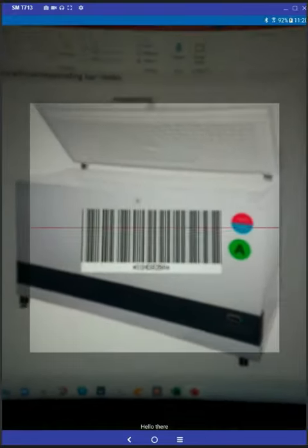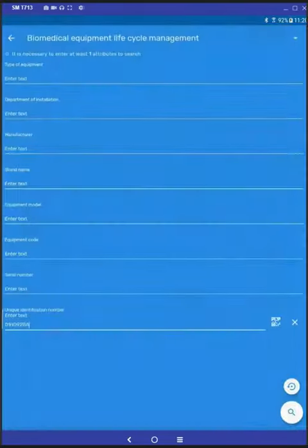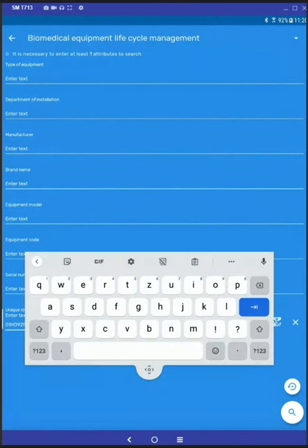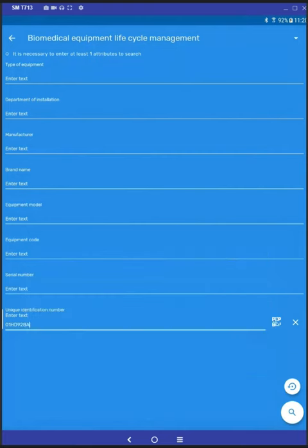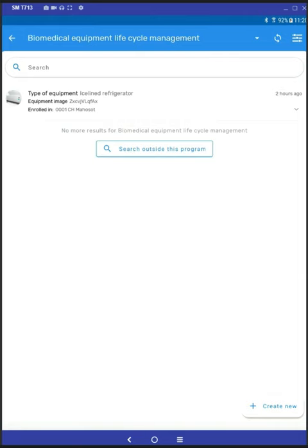Then you can scan the image of a barcode that you have attached to the equipment and tap on the search button. That will bring up the piece of equipment that corresponds to that barcode.